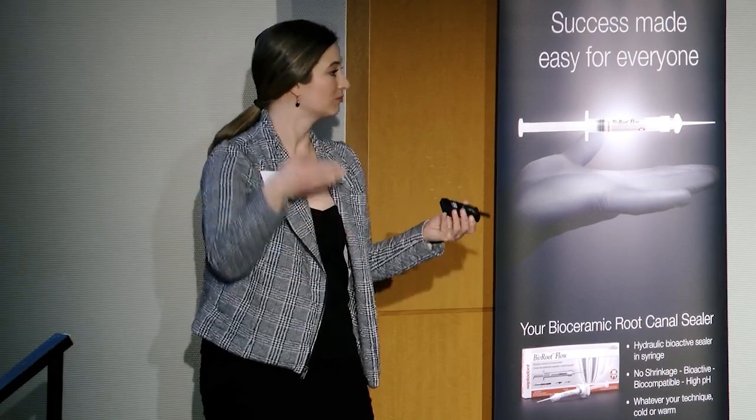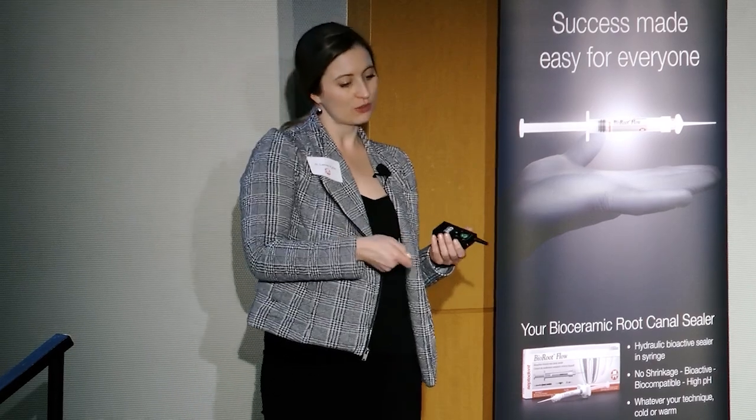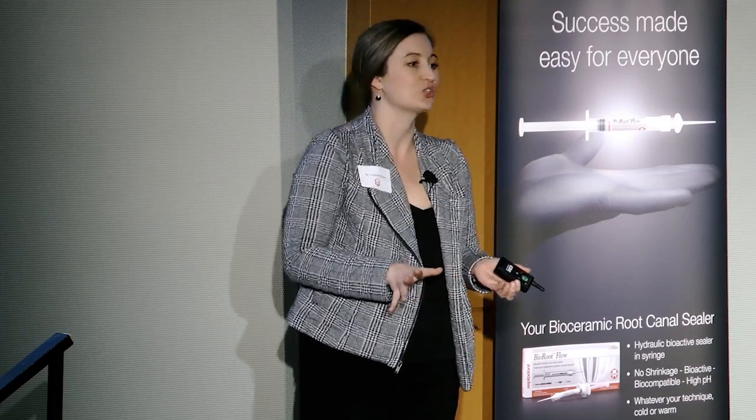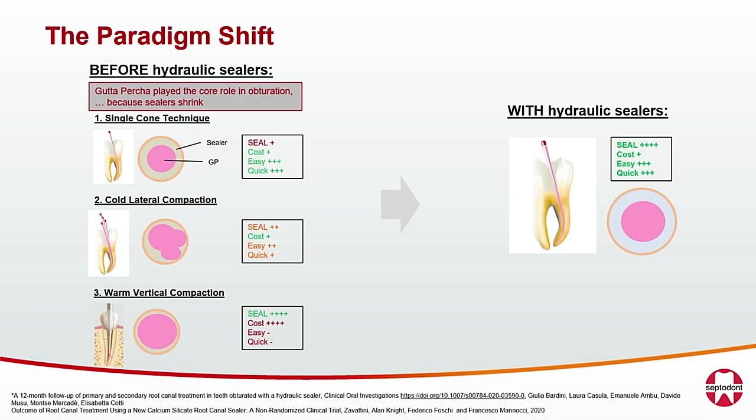The idea is that the sealer is the star of the show, not the gutta percha. The gutta percha is there to make it retreatable. It creates like a core, if you will, a pathway to retreat if you ever needed to go back in. And it also allows for condensing down in the full length of the canal to allow the gutta percha to push sealer into the intricacies of the root canal system, into isthmuses, into lateral canals, etc. So it's essentially quite similar to single cone technique, except we're thinking critically and we're using sealer that will accomplish more than what previous sealers would.